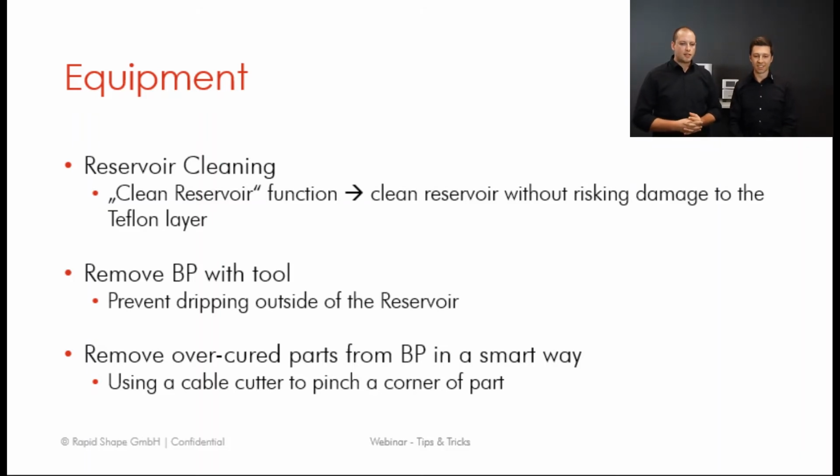Okay, the Z-axis limit screws. So yes, you're talking about the limit screws. Yes, thank you, Sean. Okay, great. So this is a different topic. Yes, a different topic. Good that we explained also the other one. About the limit switches. So this is set up previously at Rapidshape, so usually there's no adjustment needed.